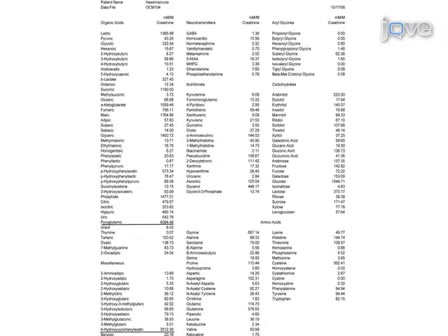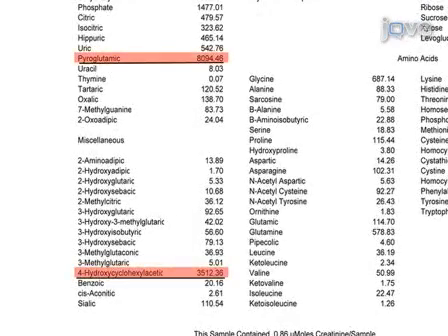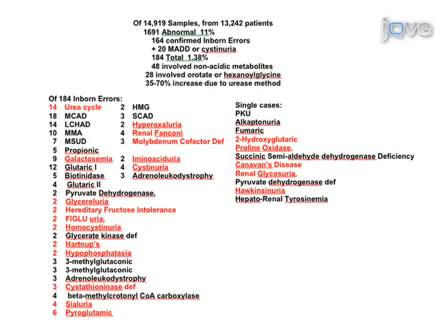The results of initial newborn screening tests can be nonspecific. However, the elevated levels of hawkinsinuria metabolites in the urine sample analyzed by GCMS, as shown here, confirm the diagnosis of this inborn error of metabolism disease. Using the same urease method, inborn errors were diagnosed in 184 patients. Close to 40% of the diagnoses shown in red would not have been made by tandem mass spectrometry, commonly used in neonatal screening.